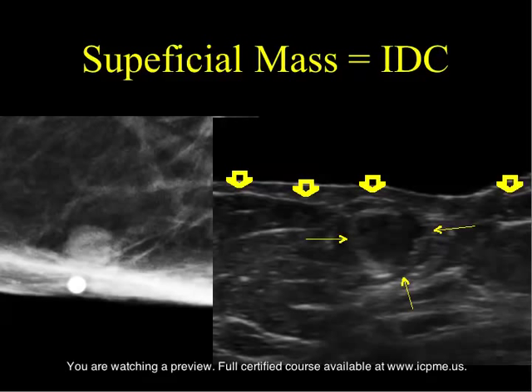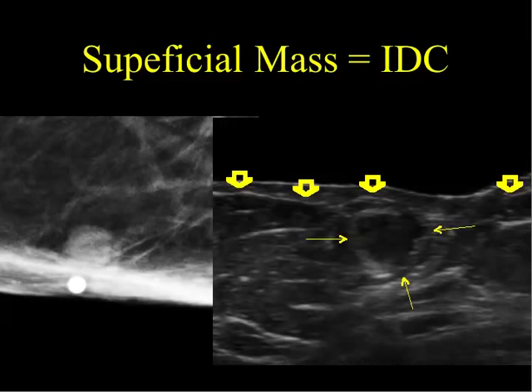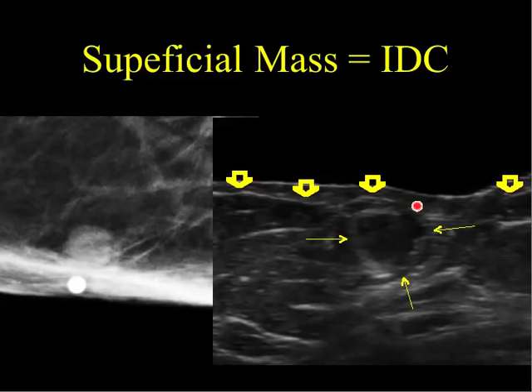Why is that important? As in the last case, we know that's an inflammatory process confined to the skin. Here on a magnified mammogram, we see a superficial mass very close to the skin line. And on the accompanying ultrasound image, also using a standoff pad, we can clearly see the skin line and recognize that this heterogeneous hypoechoic mass with an echogenic margin is below the skin. In fact, this was a small invasive ductal carcinoma.